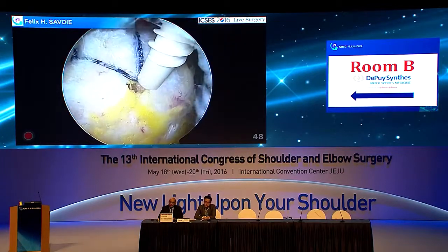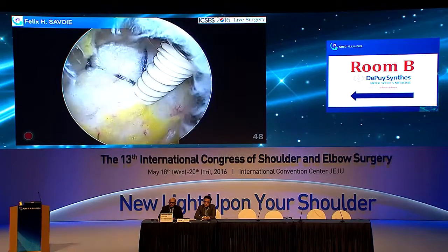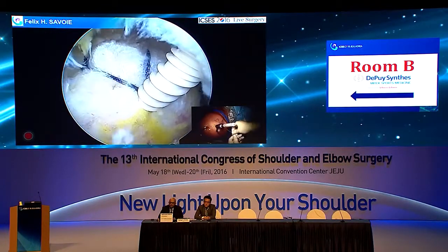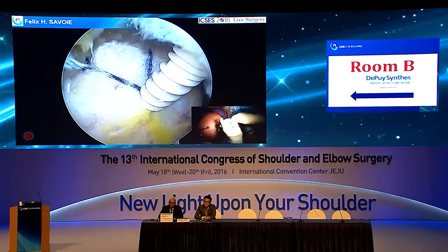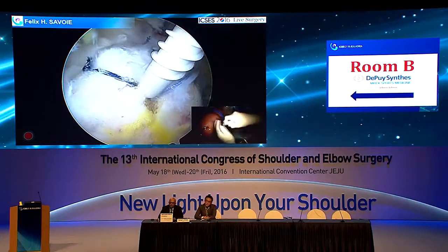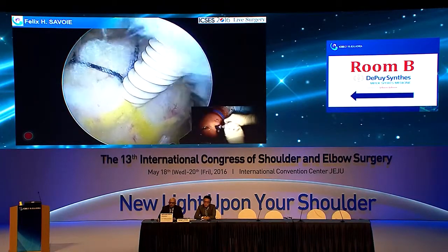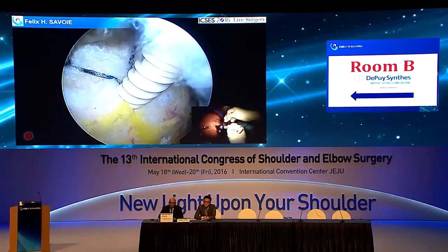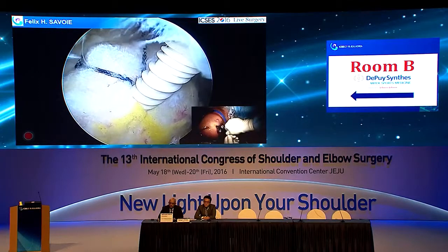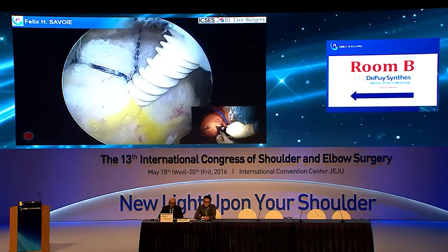Can we see inside? And we'll put this, go back in. There we go. And then we'll push that in. Make sure our stitches are about as tight as we want. We can individually tension at this point, should we choose to, if we need to. And then you can actually cleat it if you want. We could cleat it if we want, but you got to maintain a little bit of downward pressure. So see, I can do that. Then I can put it in the cleat because now it's tight. So I can individually take each suture, make sure it's tensioned.